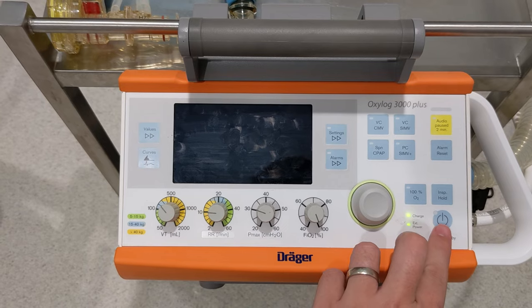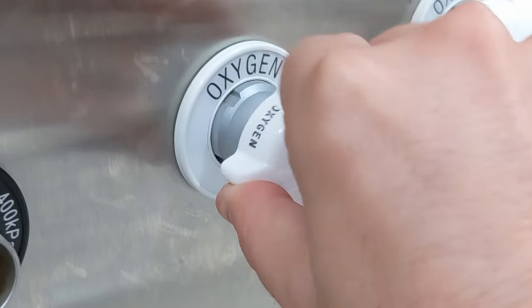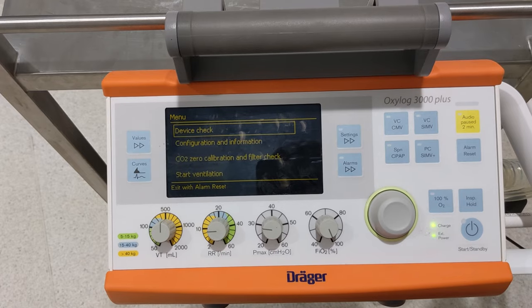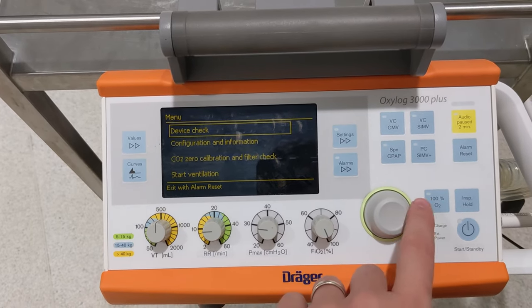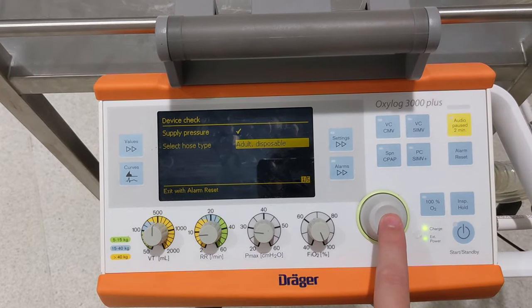Before starting, have the machine set up, plumbed to oxygen, and plugged into wall power, and also perform a device check. For how to do these, you can watch the tutorial videos that I previously made, which I'll link at the end of this video.